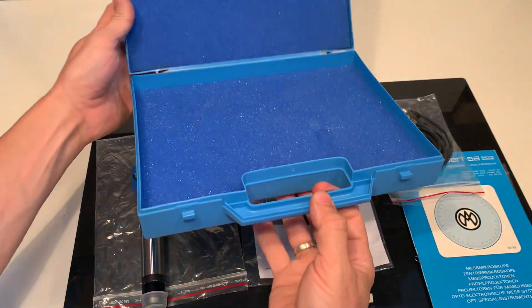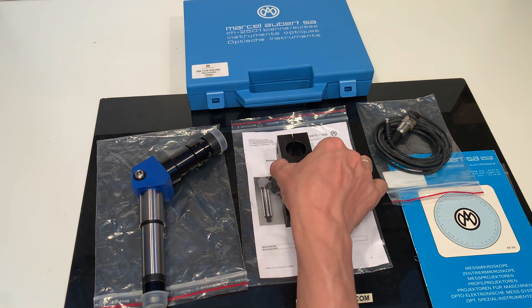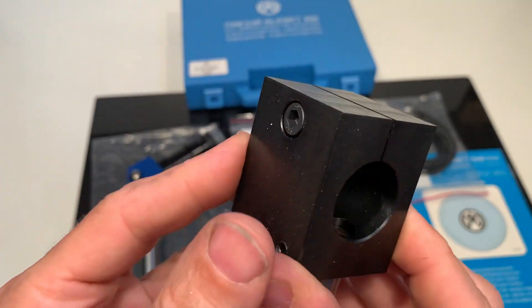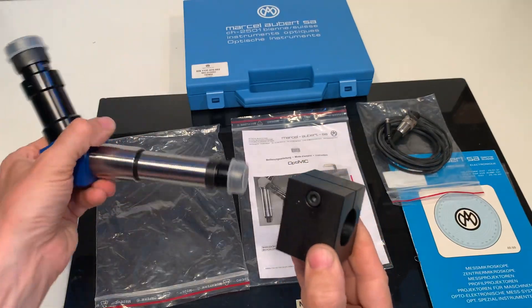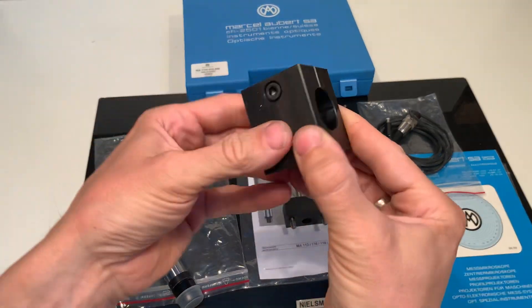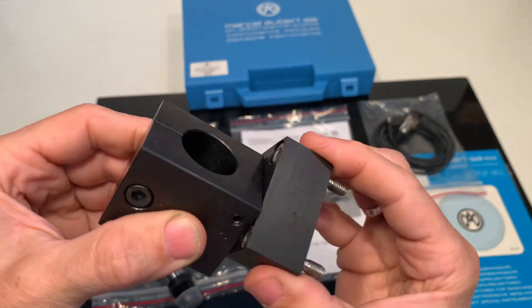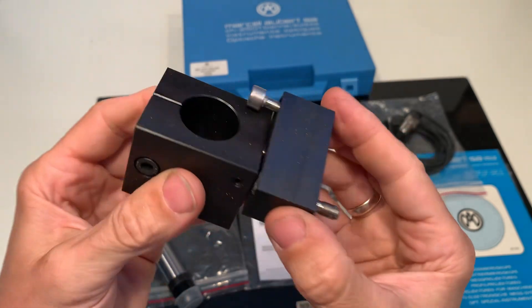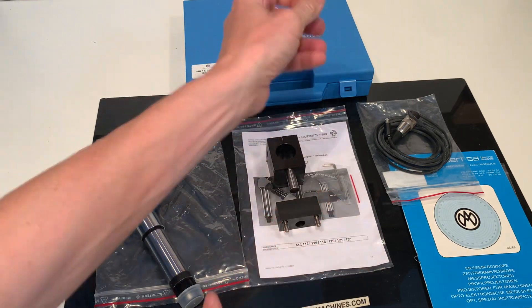So it all fits here in the box. This is a holder — a clamp for the 25mm. And this clamp fits in here. This is an ever beautiful fitting. Parts typically Swiss made.